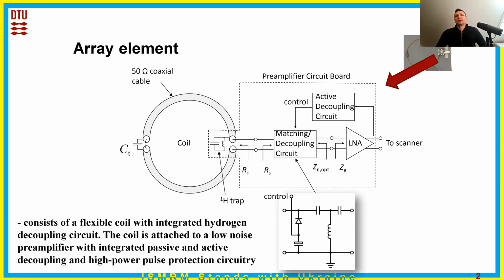The self-resonant coils can exploit a series or a parallel resonance and are often adopted as elements of flexible arrays. One example of a series resonant coil is air coils from GE. Parallel resonance coils can be realized using coupled conductors of a coaxial cable and have high input impedance at resonance. Therefore, they are sometimes referred to as high-impedance coils.